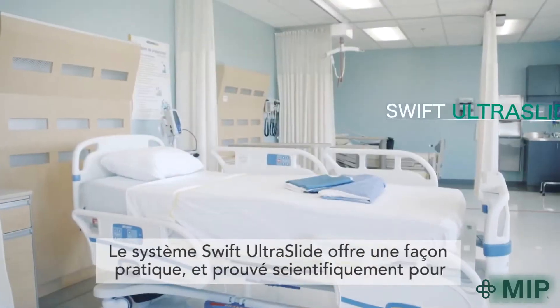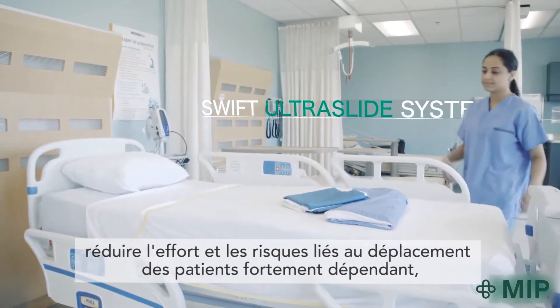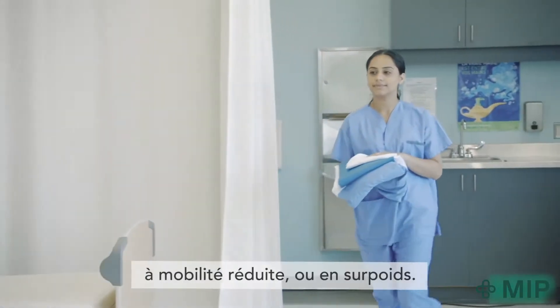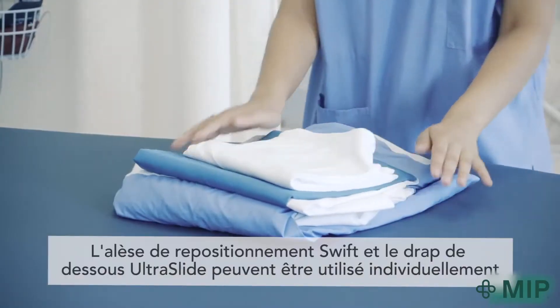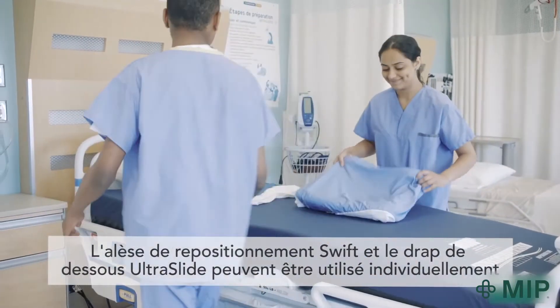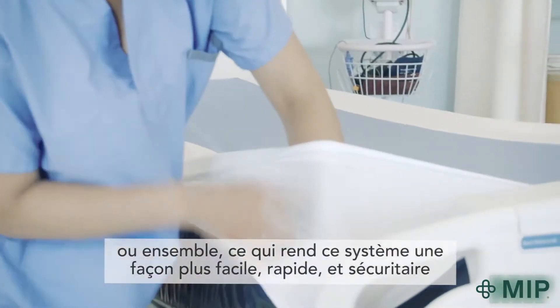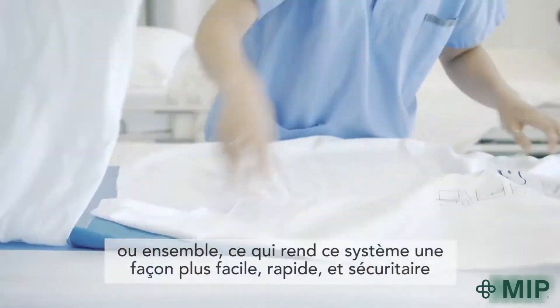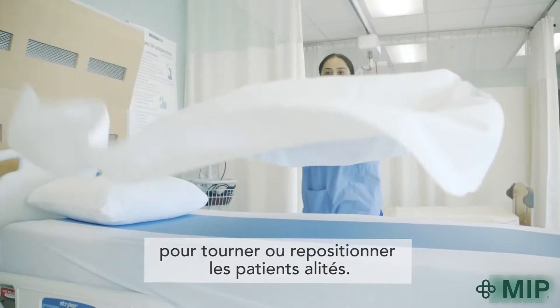The Swift Ultraslide system is a convenient and scientifically proven way to reduce exertion and risks associated with repositioning low mobility, highly dependent or heavier individuals. The Swift slider and Ultraslide fitted bottom sheet can be used individually or together, making the Swift Ultraslide system an easier, faster and safer way to turn or reposition bed bound patients or residents.